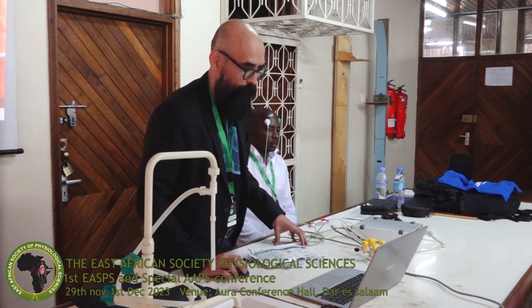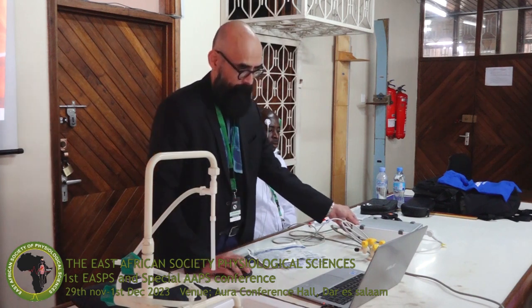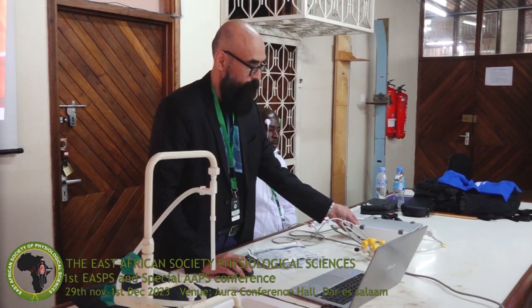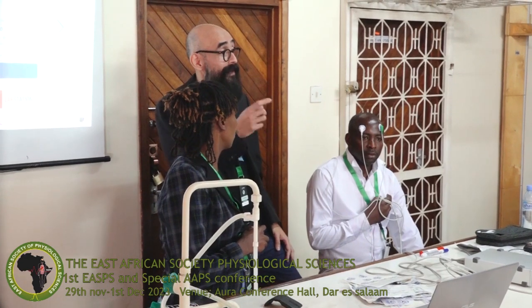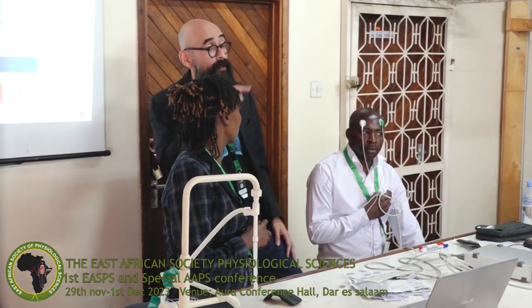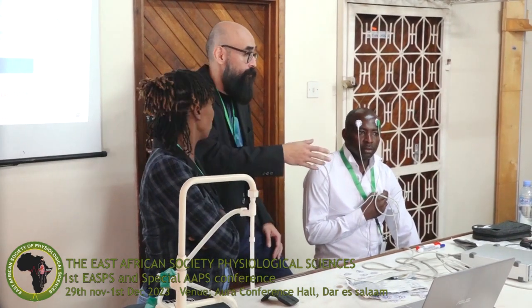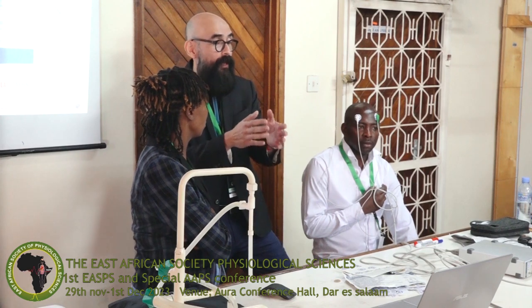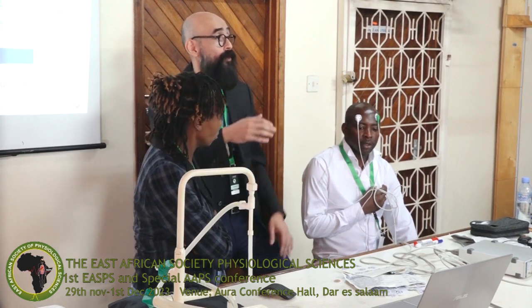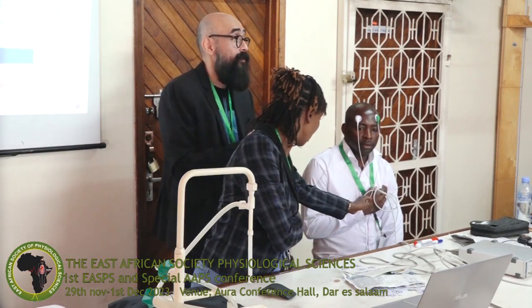That it will represent different parts of the brain linked to the activity and the frequencies that you will have. But to go in that direction and discuss with your students, they first need to be able to engage with what is going on with the frequencies and what frequencies are the ones that usually are being detected.